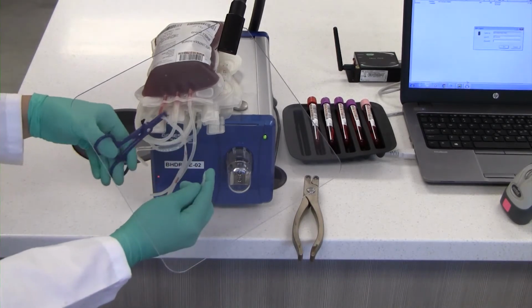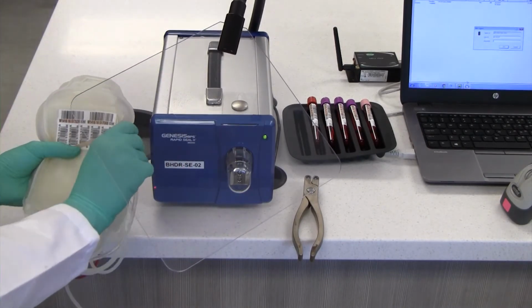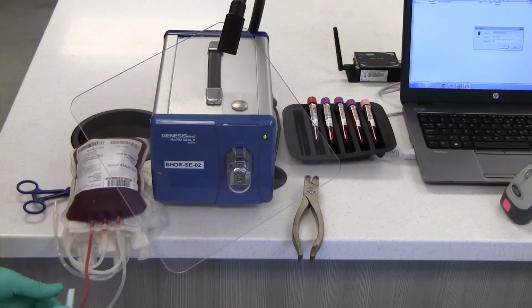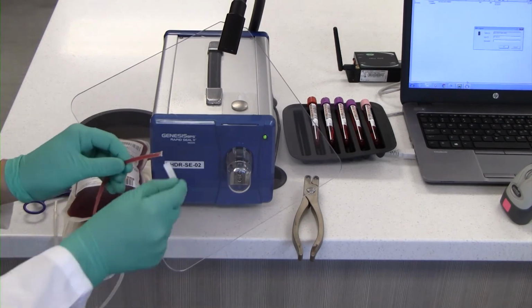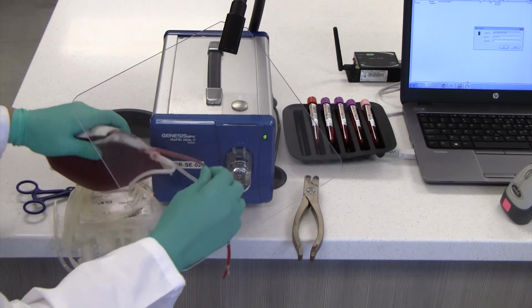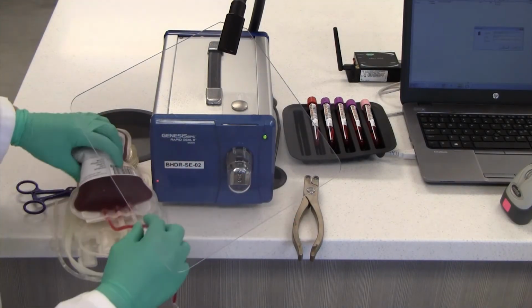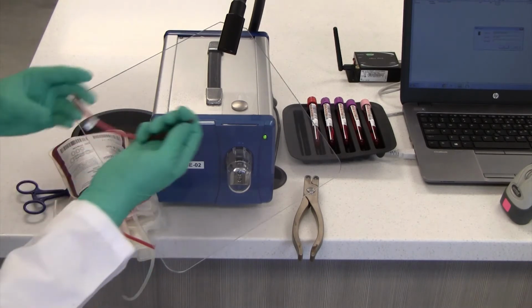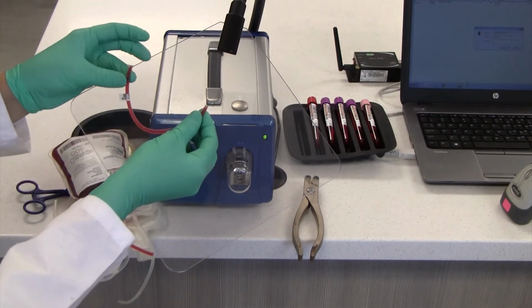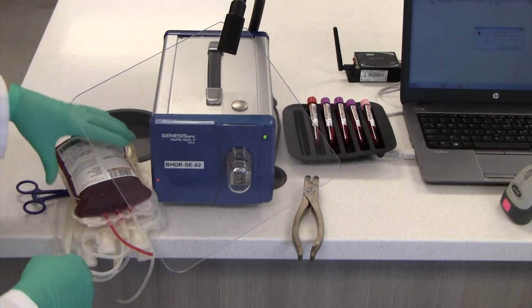Release hemostat on the tubing. Apply small DIN sticker around the end of the tubing. Seal tubing approximately 3 inches from the collection bag. Separate tubing at the seal. Verify the retention sample is labeled. Store retention sample with DIN sticker in the retention sample bag.